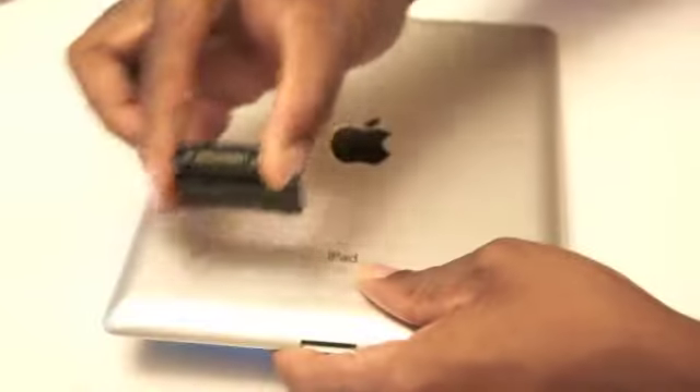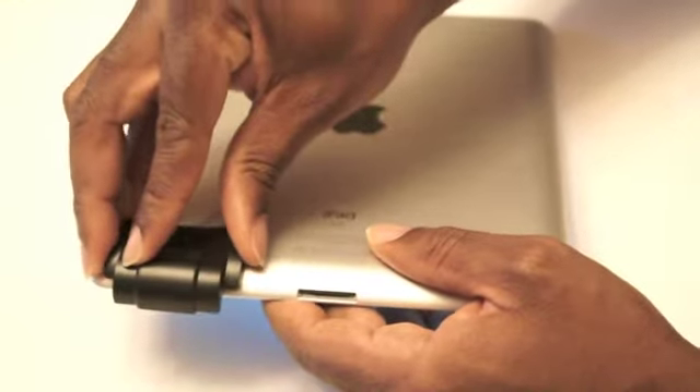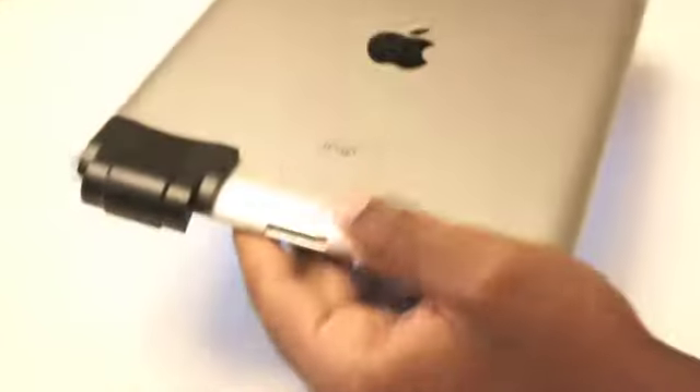Or, you can take it off and come from behind, laying it on the back of the iPad like so. The curve still matches and the FOCO is secure.